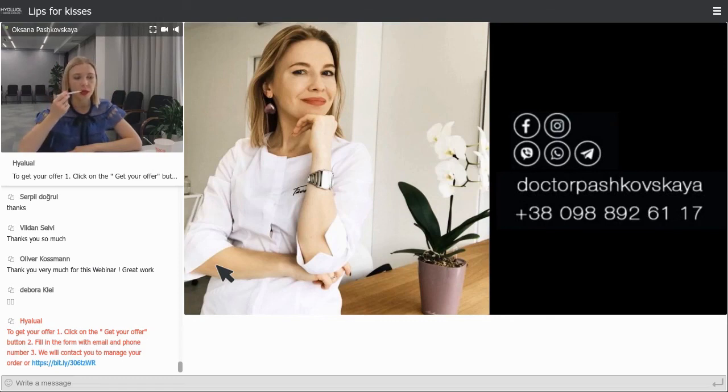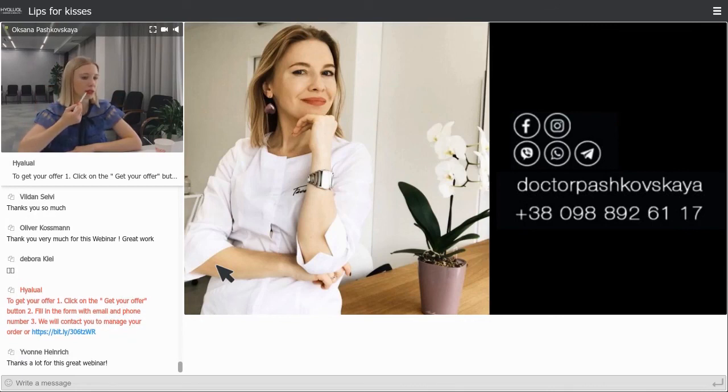The same technique, I use 0.05 milliliters more laterally in the upper lip and in the lower lip. And then you massage, and the filler could really spread evenly, and you achieve a good result without any trauma, and the rehabilitation will be as short as it could be. So yes, that's a good idea. You caught everything. Thank you, Elisabetta.